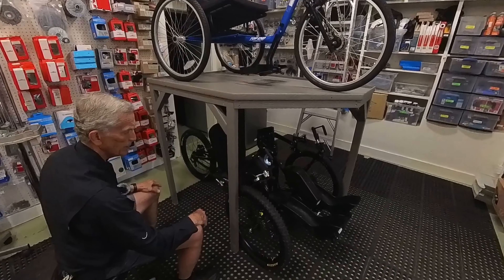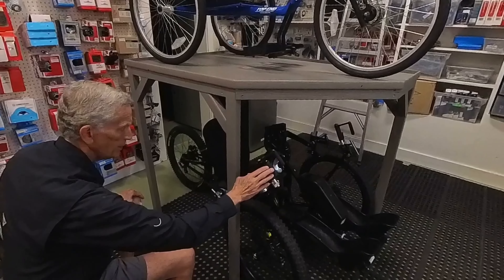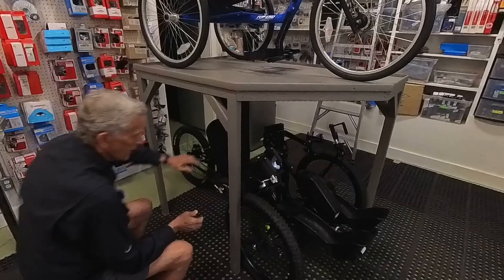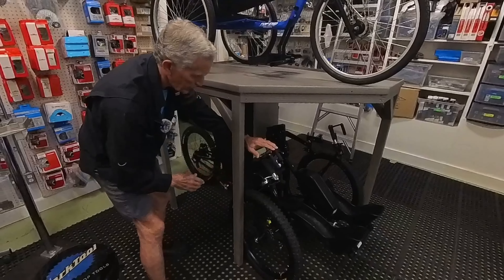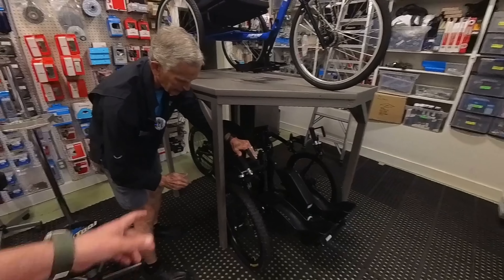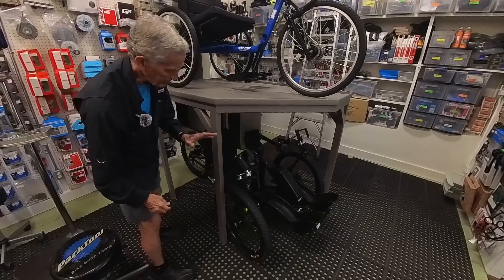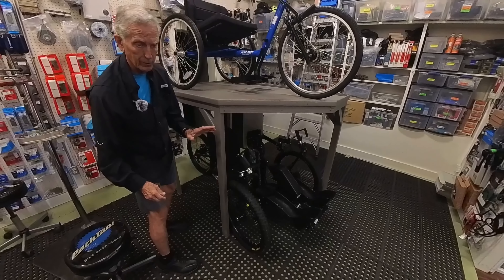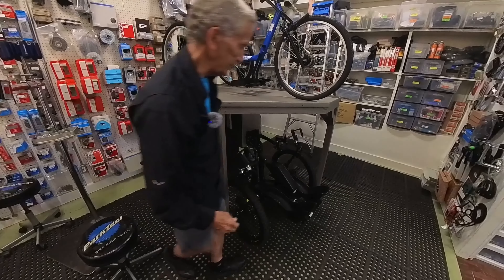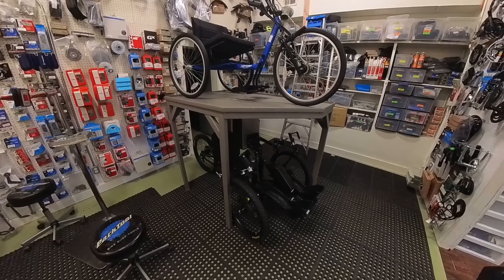With the quad grips on this mountain bike, the actual brake on this wheel — the quad has their hand through that, and the brake is activated by moving the arm. The adaptations on this are incredible. This trike is about an $18,000 trike, but it's worth everything — it's incredible.